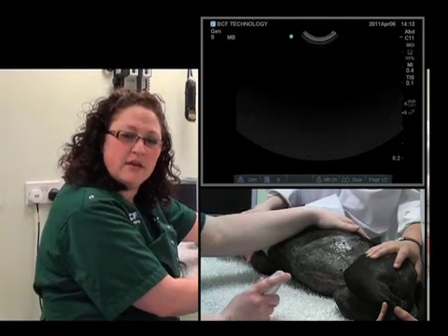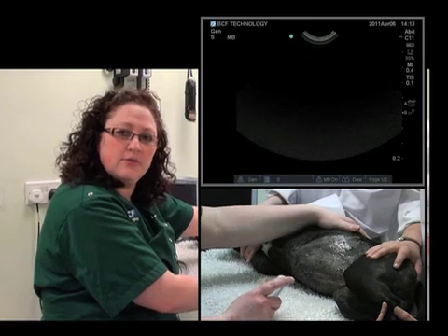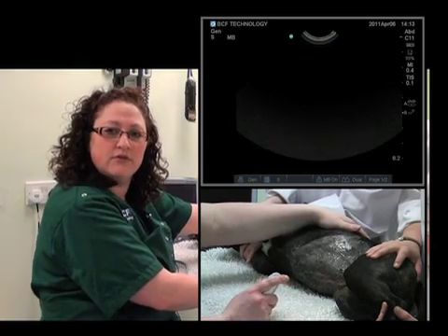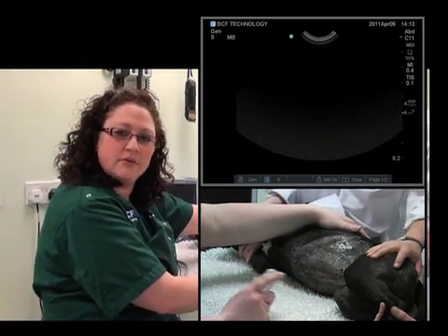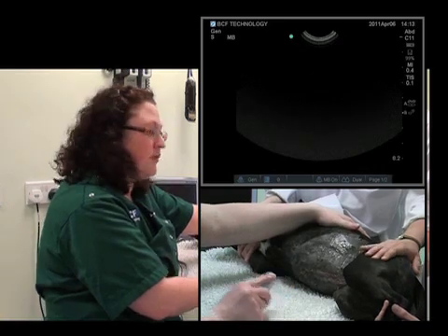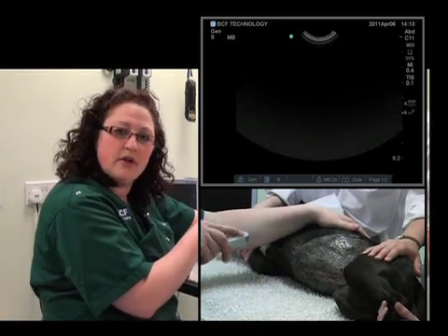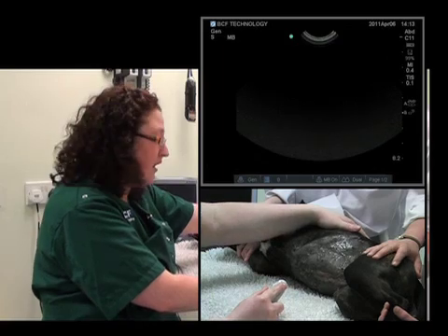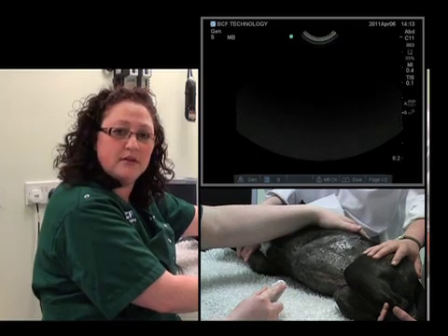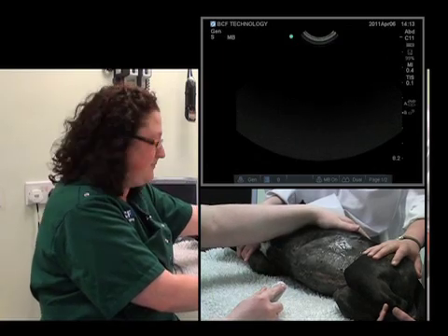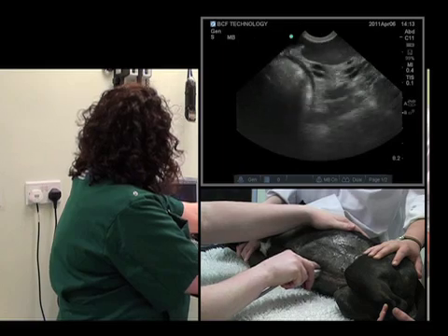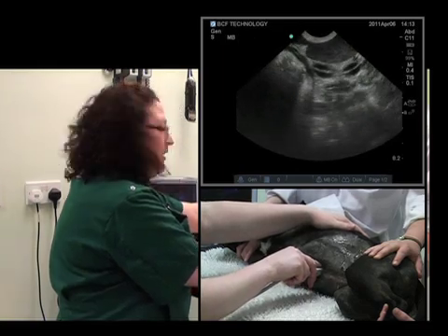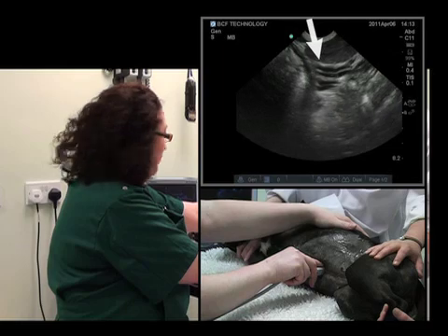One of the methods is using a technique very similar to the way a microscope slide is evaluated. So we'll start at the level of the stomach and go up, down, and across, repeating that caudally throughout the entirety of the abdomen. And there are some loops coming into view just caudally to the stomach.